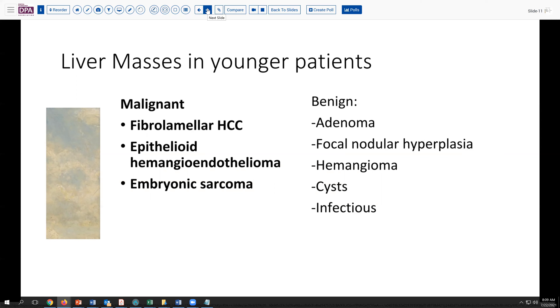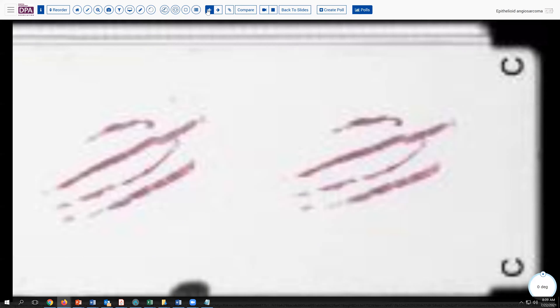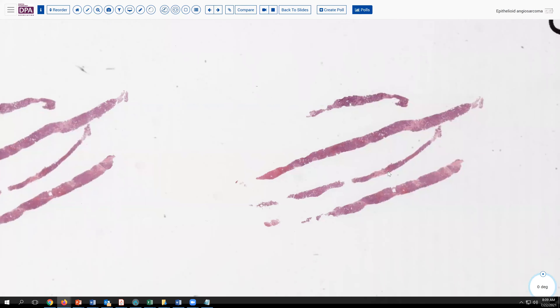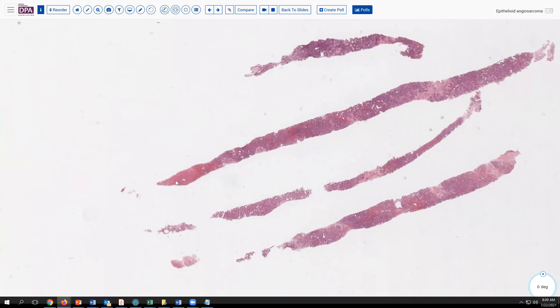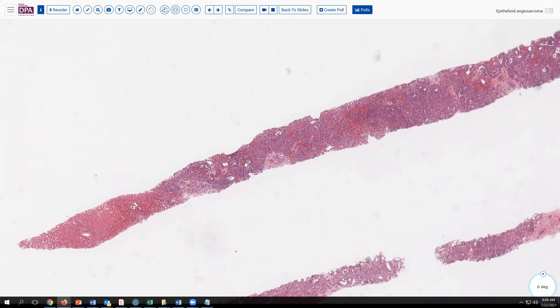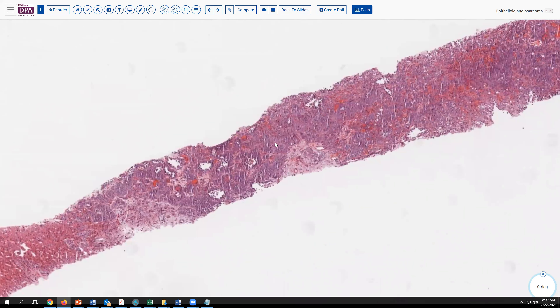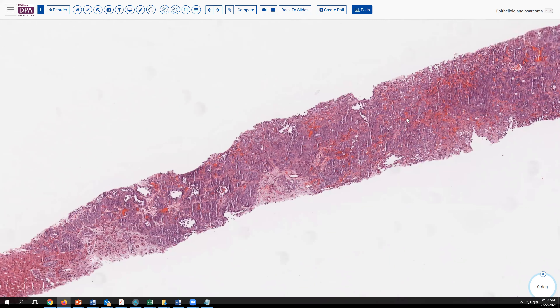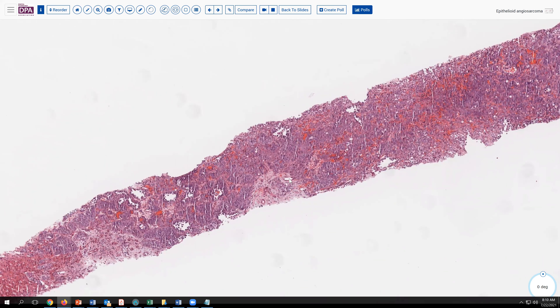Our patient did not appear to have a cystic lesion and a biopsy was performed, which we see here — several core biopsies from the liver tissue. At intermediate magnification, we see a little bit of normal liver, and then we see this neoplastic proliferation through much of the length of the core biopsies. There is a nested pattern, so we might wonder about carcinomas, but notice we also have some open spaces here and a fair amount of blood in the background.